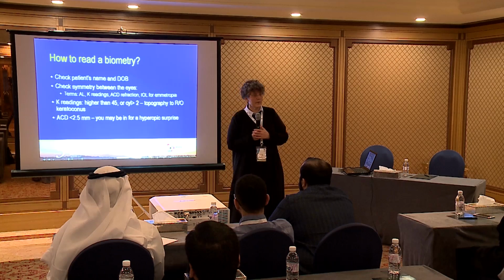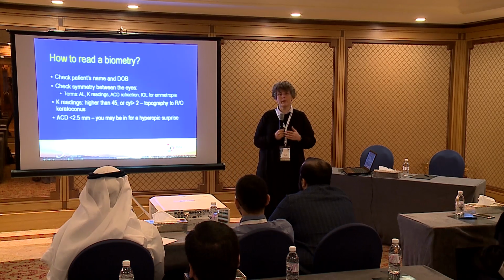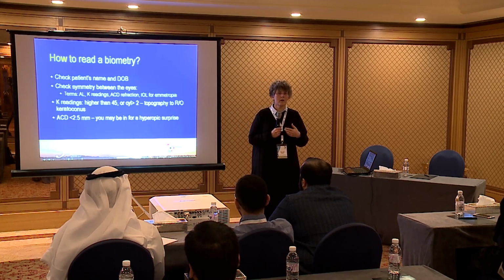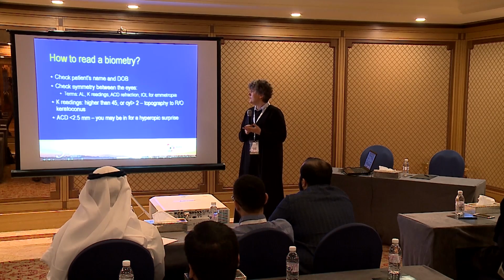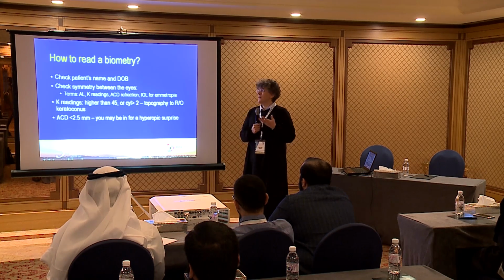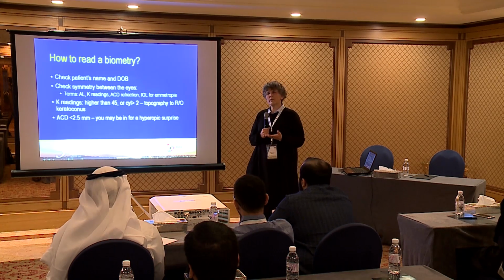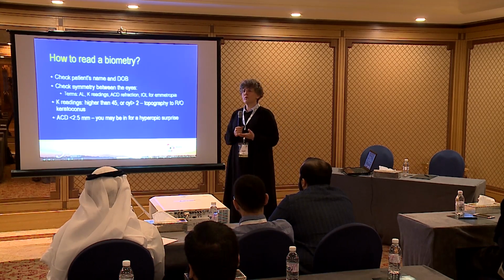Eyes should be symmetric unless people really have a big anisometropia, and then you'll know. It will read out in the axial length. You will see it in the axial length. Okay? And then, depending on your means, depending on your time, depending on the type of the practice that you run, you decide when to do a topography.